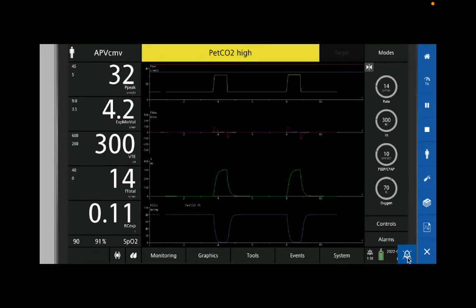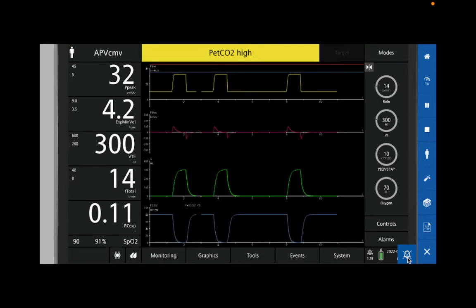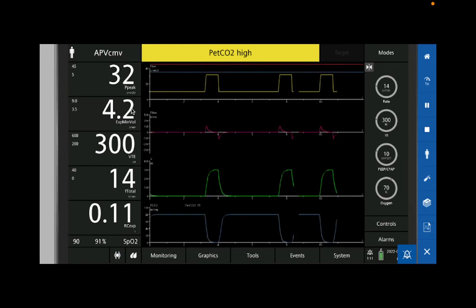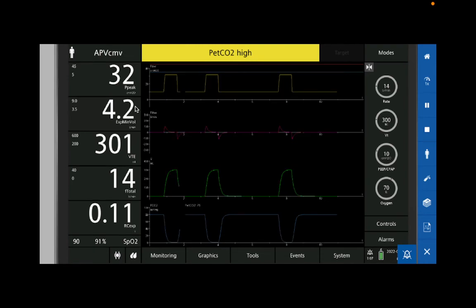Second reason, what is his tidal volume? It's low, so if we're reducing someone's tidal volume, how do we compensate? Increasing the rate. So we should have known this was coming. We should have gotten ahead of this, right? We've talked about minute volume before, the amount of air they breathe in a minute. His is low because we've reduced his tidal volume. So anytime you're doing low tidal volume ventilation, we have to compensate by increasing his rate.